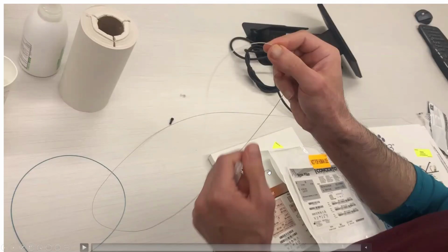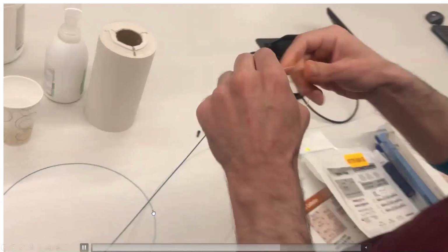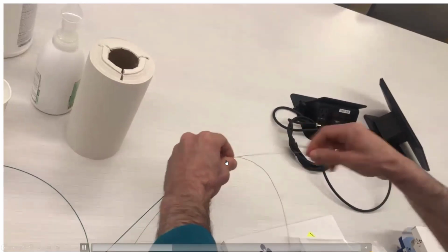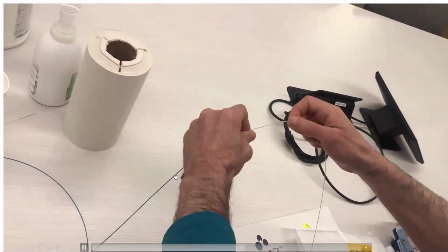Now, how to exactly deploy those coils into the coronary? You have that microcatheter Fine Cross in the perforated branch. You bring that white introducer sheath and you insert it into the microcatheter, as you will see here. You insert it into the microcatheter. After you insert it for a couple of centimeters, you push the back wire through the introducer sheath. You push that back wire, which will push the coils into your Fine Cross.